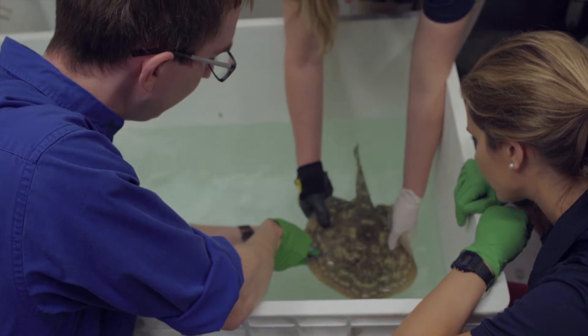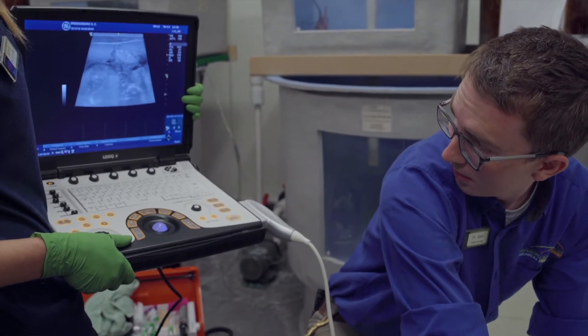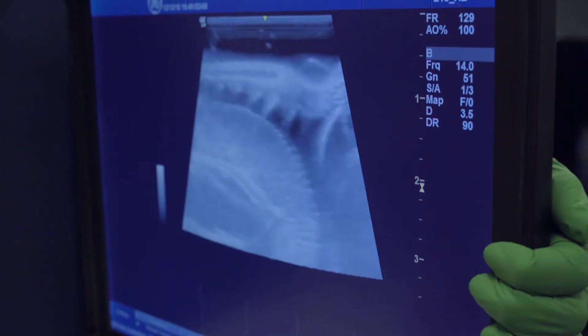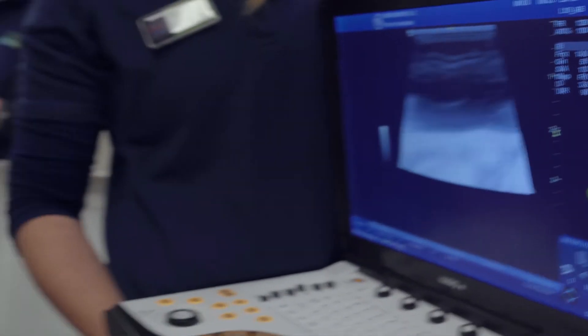We'll also be collecting a blood sample, and doing a diagnostic ultrasound just to see if we see anything interesting. We can save those images and compare them with each subsequent exam as well.